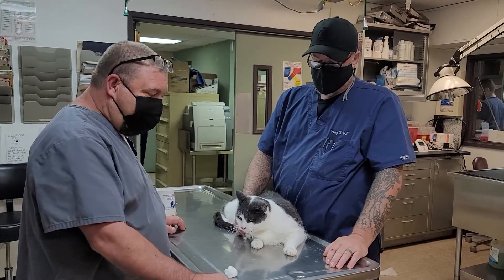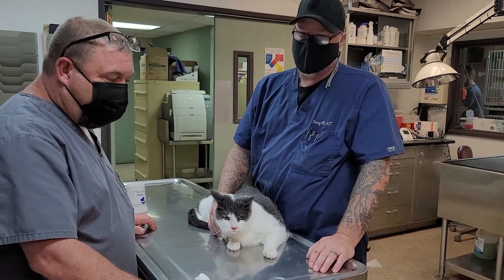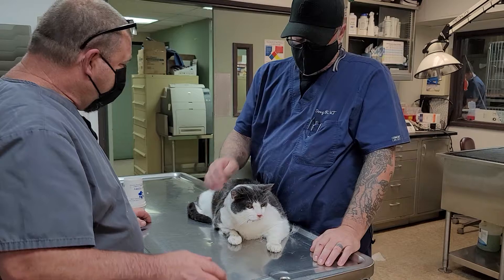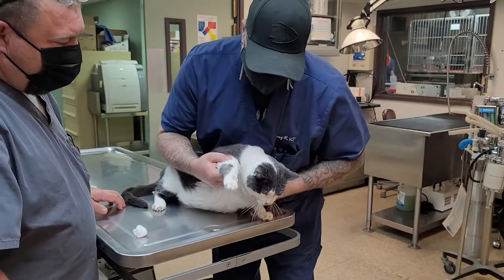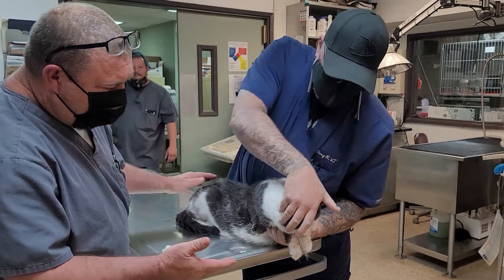Hello. We're going to demonstrate a good technique on how to pull blood from a cat's jugular. Normally people stretch them over the table and do this, which we're not going to do because I don't want to make the cat angry.